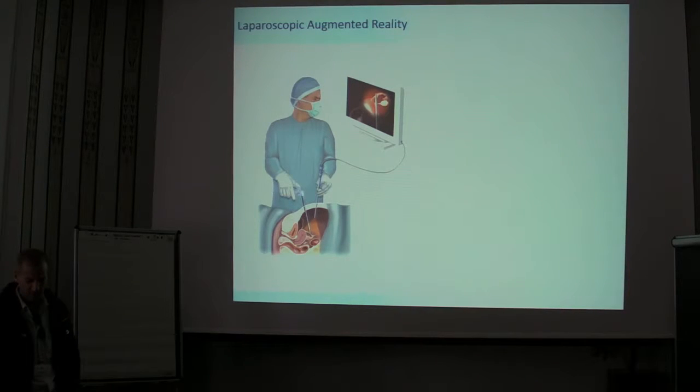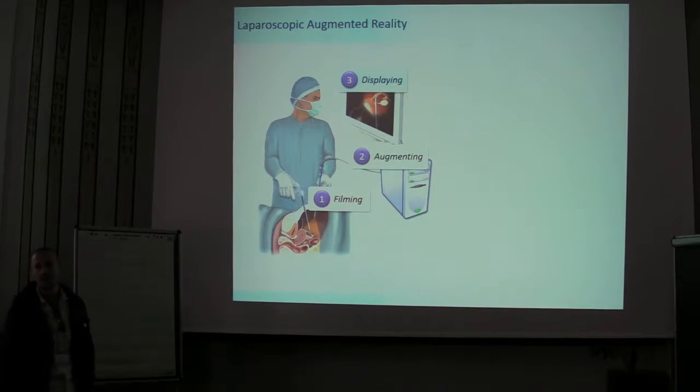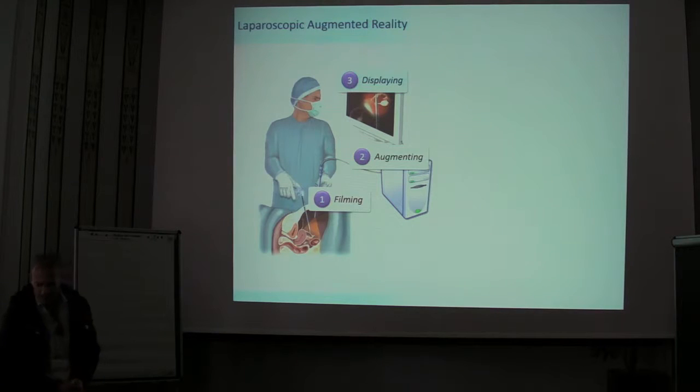Really brilliant what they can do. And for us, what's nice is that, of course, they're filming, they're displaying, so we just have to go to the OR and plug a PC in the middle, and we can do augmentation. That's as simple as that.